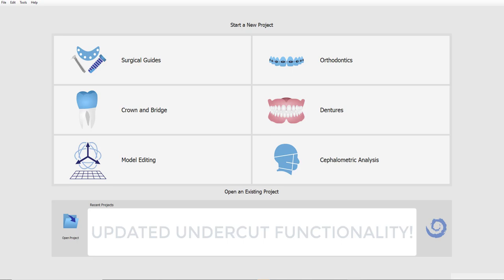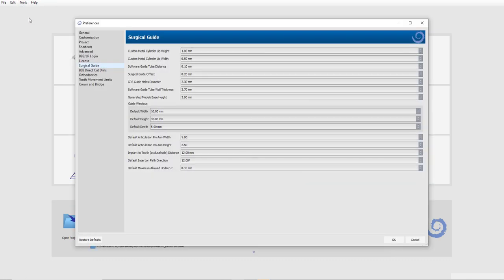And to demonstrate how the undercuts were being removed, we generated an undercut model. We could see what the default settings are by going to surgical guide and checking default insertion path direction. So as I mentioned, in the previous release, it was set to 30 degrees.